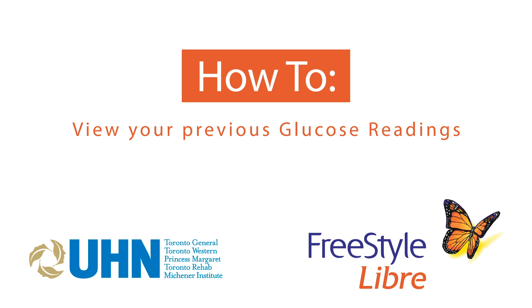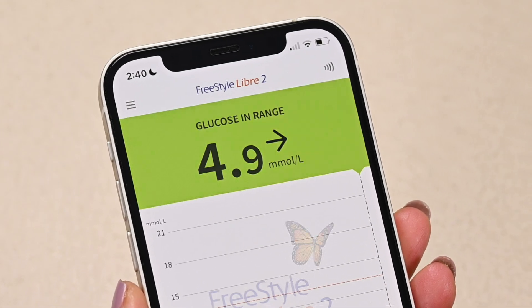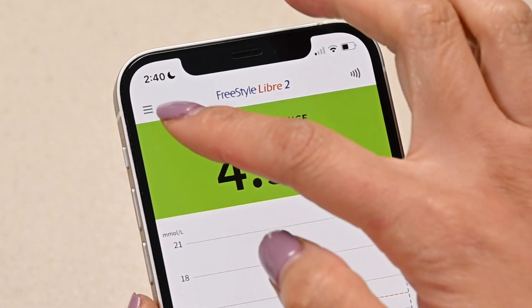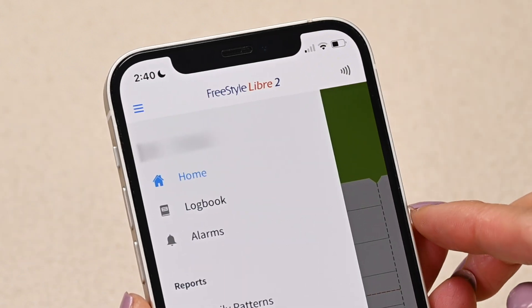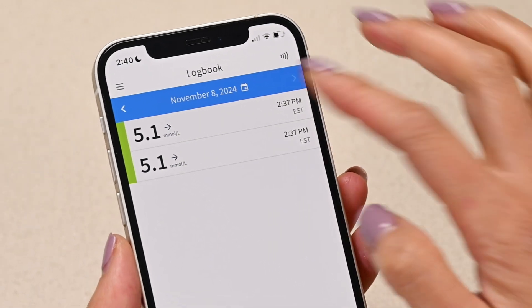How to view your previous glucose readings. The easiest way to view your previous glucose readings is through the logbook. Tap the menu button, which are the three lines in the top left corner, then logbook. The logbook will show you your previous readings listed by date.